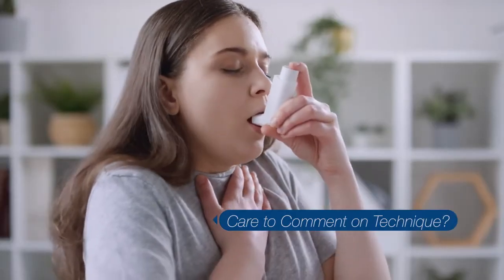Something else that really helps is asking patients to always bring their inhalers in when they come in for review. Asking them to demonstrate how they use their current inhalers will give you an idea as to any problems with things like dexterity or inspiratory flow, so that even if you are going to switch inhalers, you've got an idea on how the patient's currently getting on and whether inhaler technique might be the cause of their therapy not working.